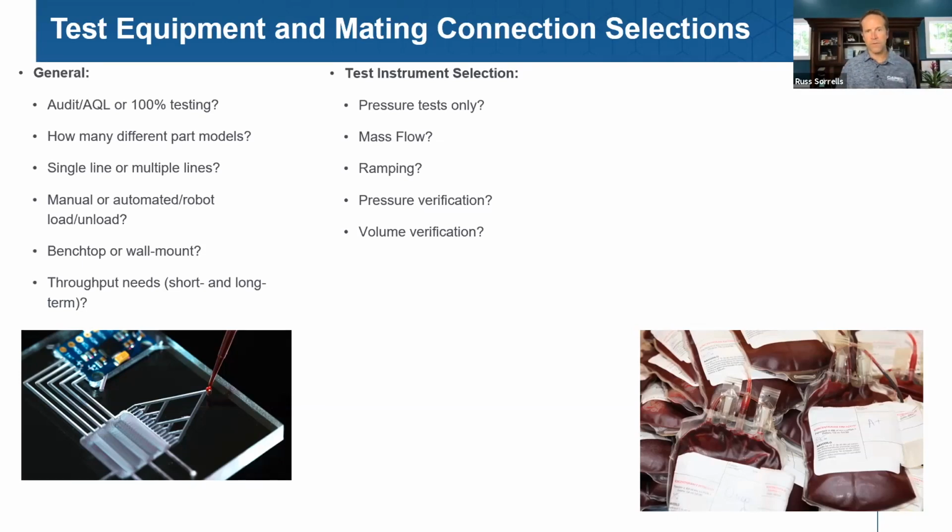So if we know that up front. Another way to explain this, and this is a common question that I get from customers when they are thinking about, gosh, how do you verify the volume? Well, we take a known volume that we pressurize to a specific pressure, and then we expose the test part to that known volume, not adding any additional air, and the two balance out.